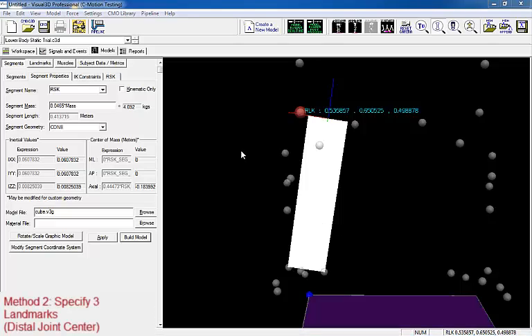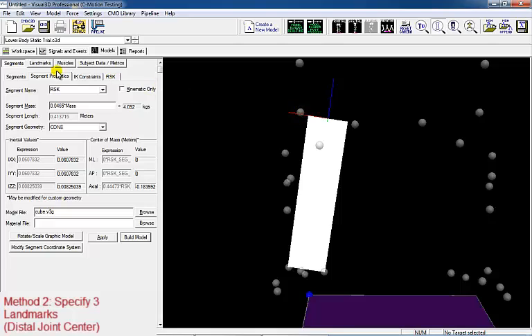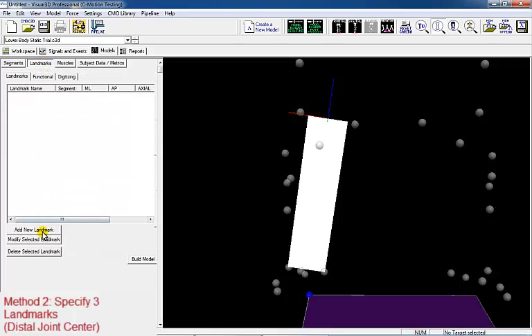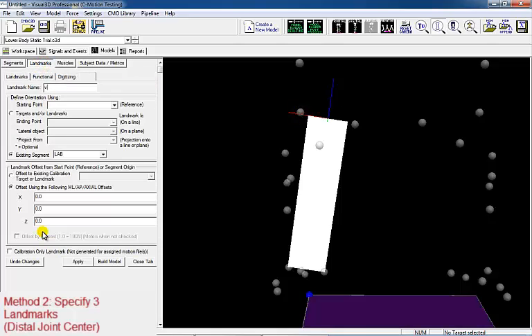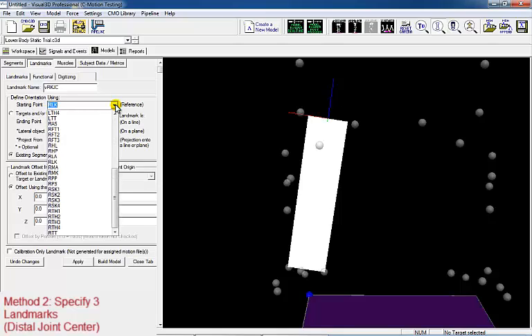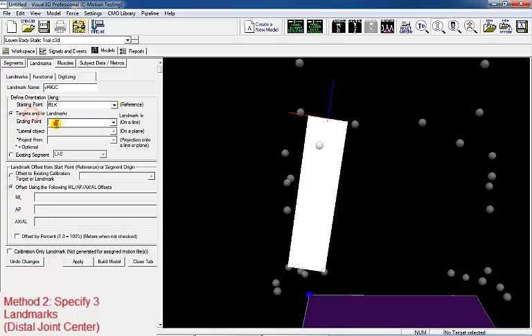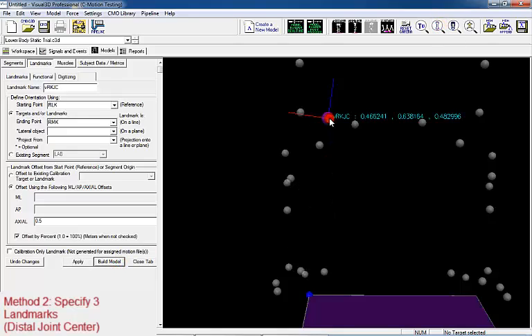Now we're going to define the shank segment using three targets. First, we're going to create a virtual knee marker between the lateral and medial knee markers. The actual name of the virtual marker does not matter, but I'm going to use 'virtual knee joint center.' We're going to create the knee center on the line between the lateral and medial targets and offset the virtual marker halfway between both targets. Apply and build the model and the target will appear in purple.